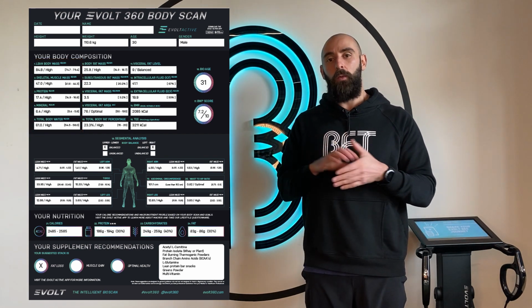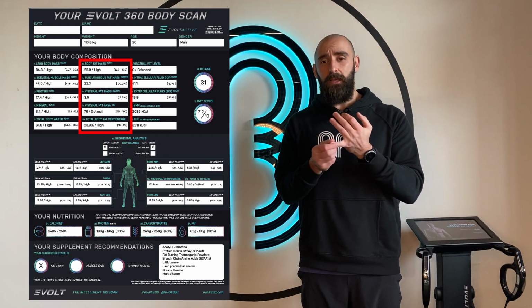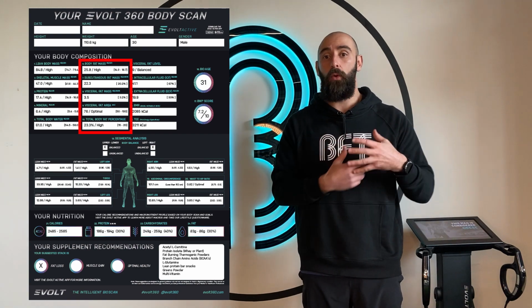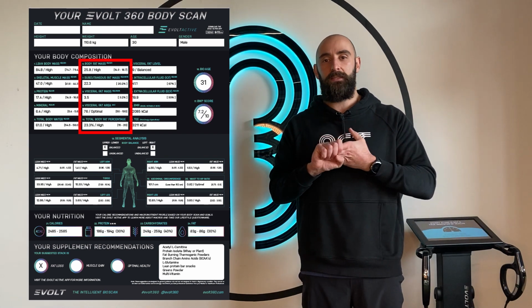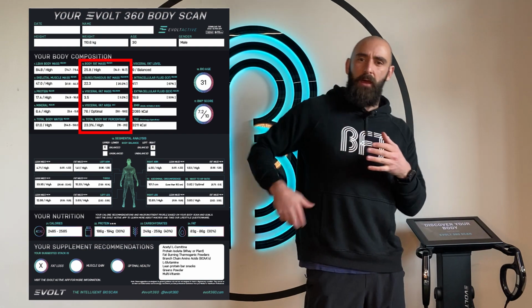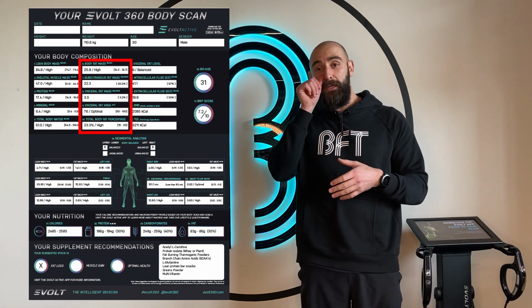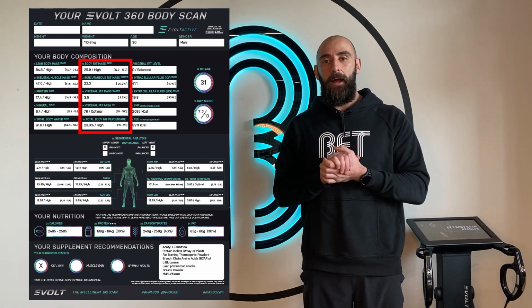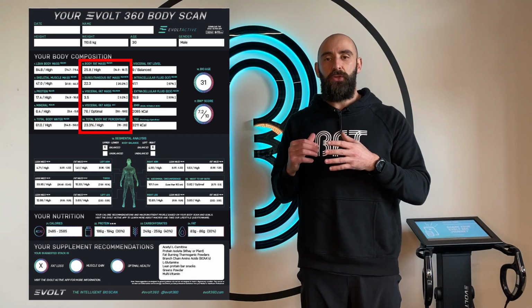Now in that second column, what you'll see is everything pertaining to fat. So fat's broken down into two regions. So you've got subcutaneous and visceral. The visceral fat is the unhealthy fat that lines our organs. It's a precursor to type 2 diabetes, to cardiovascular disease, to illnesses and comorbidities. The subcutaneous fat is the one that sort of sits under our skin. For me, it sits sort of right here on the belly or on the thighs, and it's the one that we don't really like the look of on ourselves when people are like, oh, I want to lose some fat, or I want to lose weight, or I want to lean out. That's generally the one we're talking about. It doesn't have much of a purpose other than more of a reserve or a bank for some calories. So that's the fat there.